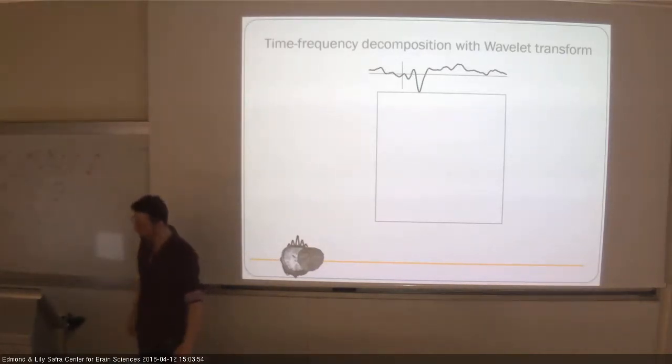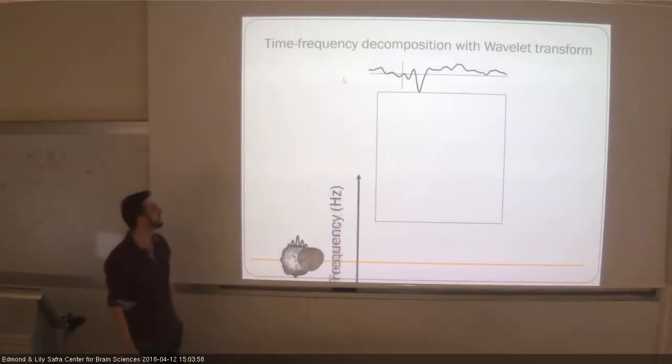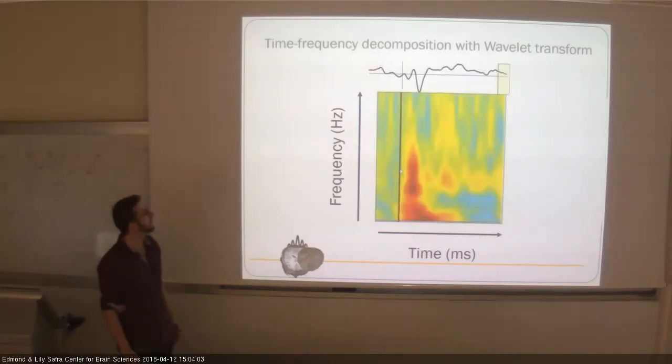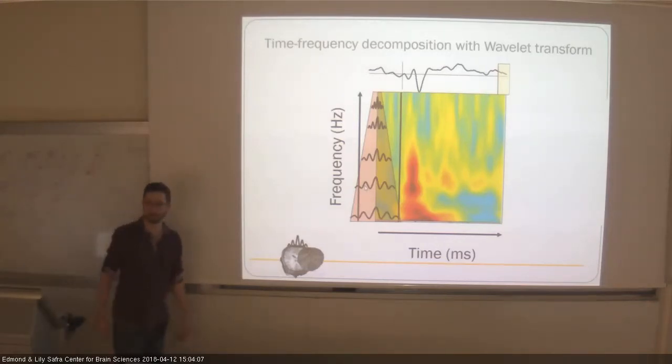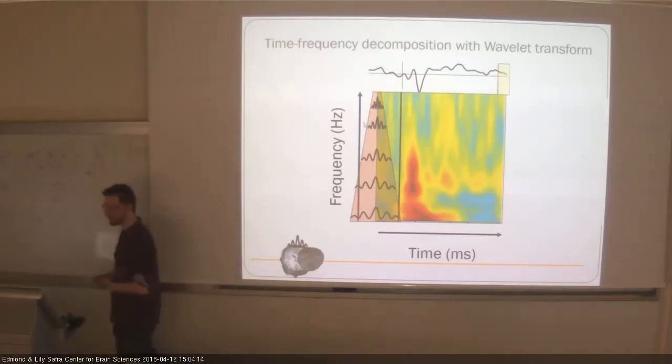So this is what we want to create. It's based on a short function called a wavelet, and there are different types of them.